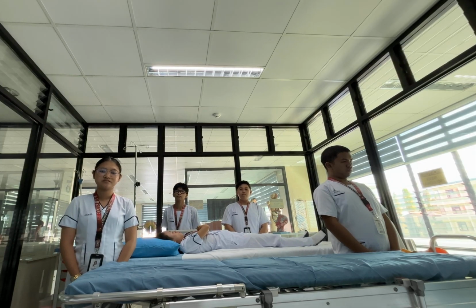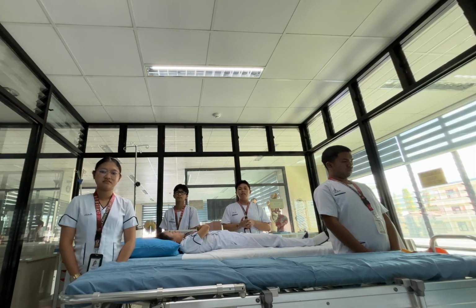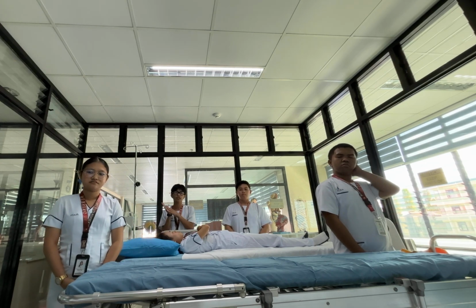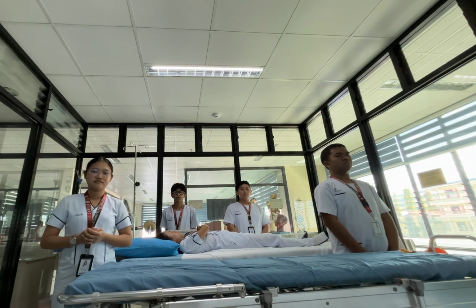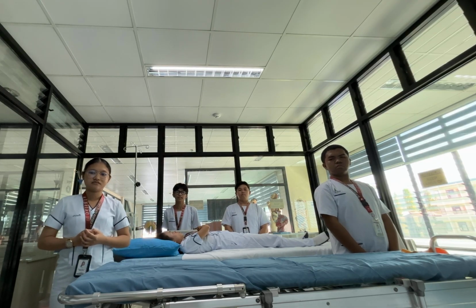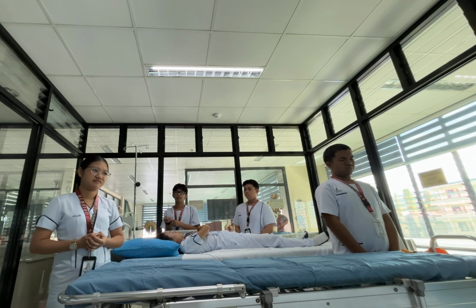For the safety and security measures, first is to lower the head of the bed, second is to place the stretcher parallel to the bed, and lastly is to ensure the wheels are locked. For the pre-procedural preparation, first perform a medical hand wash, introduce yourself to the client and identify the client's identity, explain what you are going to do, why it is necessary, and how the client can cooperate. Then gather the necessary equipment, provide privacy, and make sure to use proper body mechanics. Then let us now proceed to the procedure proper.